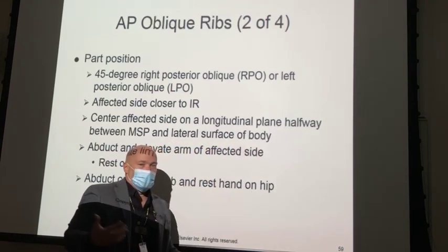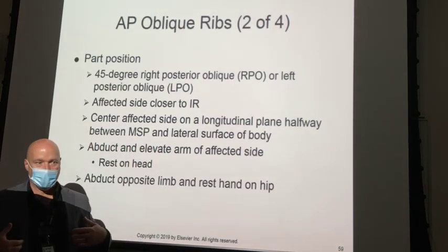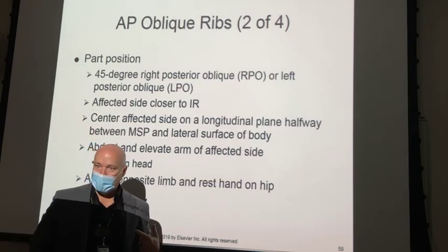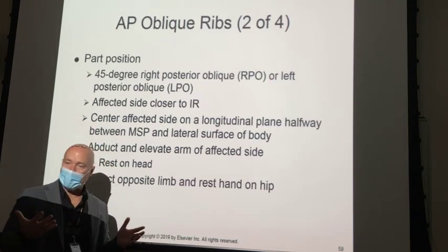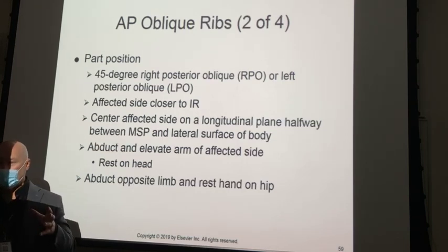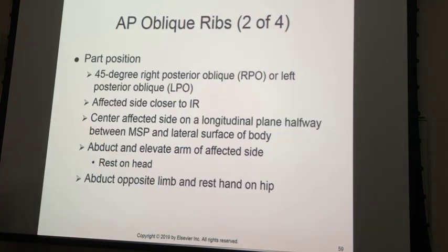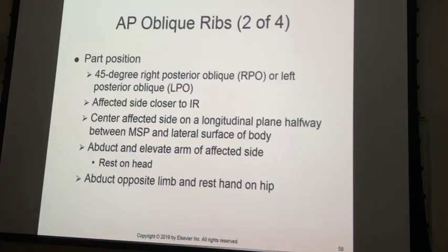So in AP versus PA, generally I would shoot according to the patient's pain. If the patient was complaining of anterior rib pain, I would shoot PA. But on the obliques, I almost always did my obliques AP, because on the PA oblique you take the anatomy of interest and elevate it furthest from the image receptor, as opposed to AP ribs, where you put the entire rib closer to the image receptor as you oblique the patient. But just know you're going to run into two questions, maybe on this test, and the accepted answer through the literature is that if a patient has anterior rib pain, you shoot your ribs PA or AP? PA, yep.